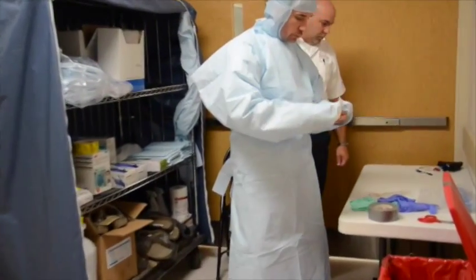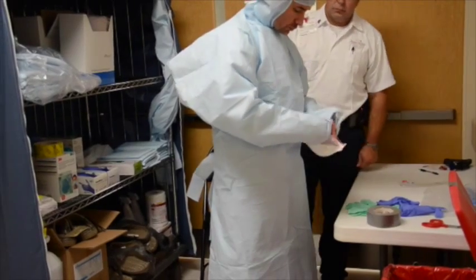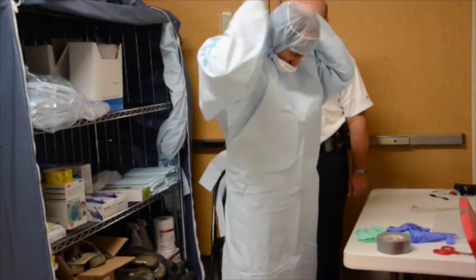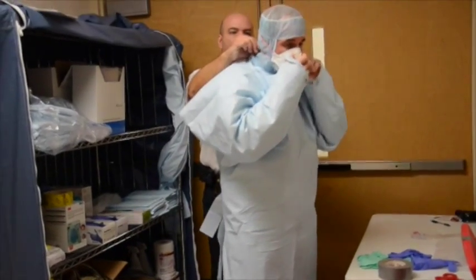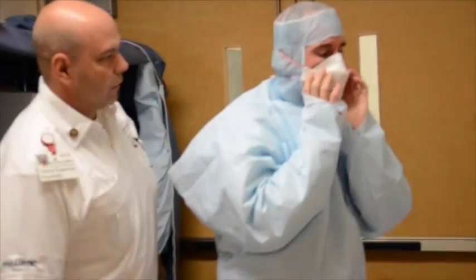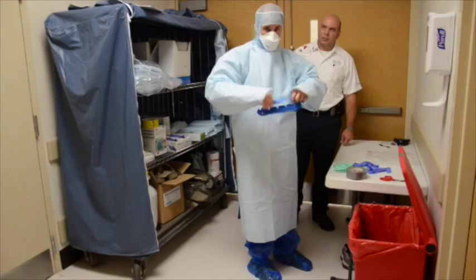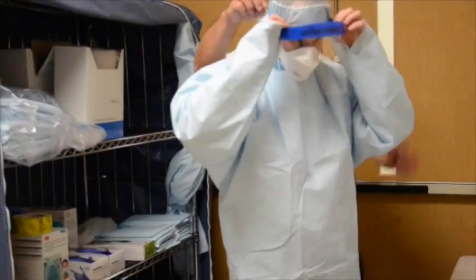Apply N95 respirator, ensuring straps are properly located behind the neck and the crown of the head. Ensure mask seal is good. Buddy will ensure proper strap placement. Don face shield over top of hood and N95 straps. Buddy will ensure proper coverage.